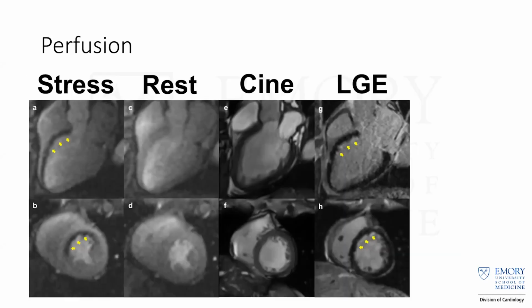We do perfusion images as well. Pretty much every time, our protocol is to use gadolinium contrast on these patients. You can do stress testing with MRI. So we'll do adenosine stress testing or dobutamine stress testing on these patients. And so you get rest perfusion images, and then you get stress perfusion images with the gadolinium contrast administration when the patient's at stress.